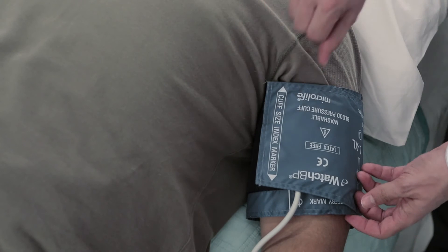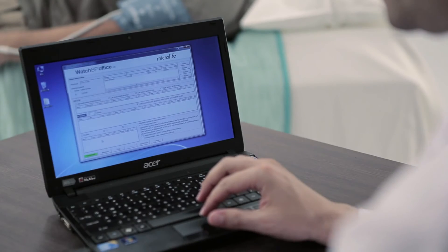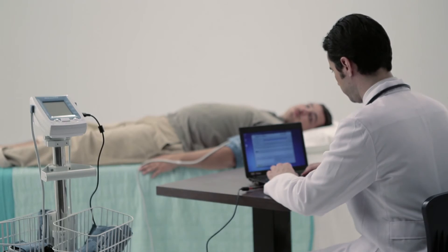Watch BP Office ABI detects atrial fibrillation during both single and double arm blood pressure measurement. You can start the measurement either by device panel or by laptop. Measurement data will be transmitted to your PC via USB connectivity.